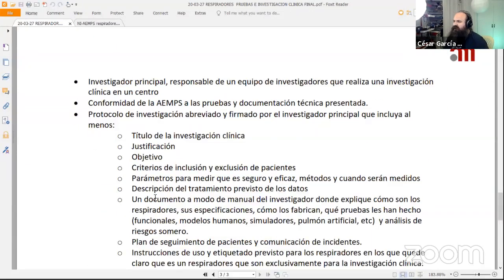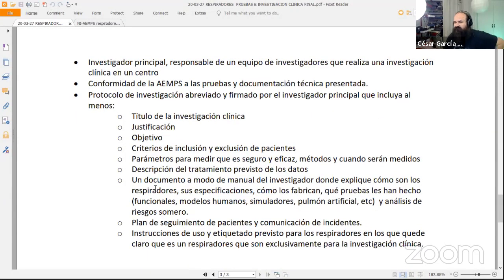the requirements. The trials are about writing the documents so the doctors know how to use the machine, teaching them how to use the machine, and specifying what your trials are. And also one of the things that maybe was the least expected was electromagnetic trials, to make sure that your device is not going to interact with any other device in the intensive care unit. But the agency has offered, okay, if you bring the prototype, I will do this for you in one of our labs. So far, I think they are quite open to this idea of having these ventilators under clinical trial and supporting these teams. But yes, there are some minimums. And so far, I think this is the situation in Spain.